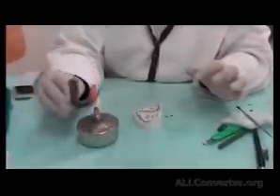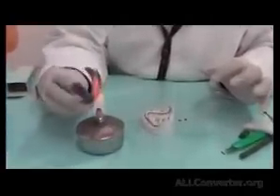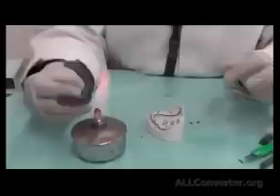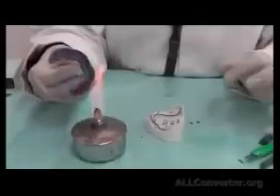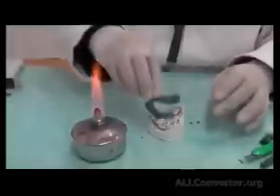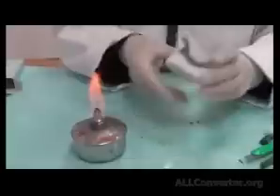And once I feel it's suitable to be placed in the patient's mouth, I heat it for the final time. I make sure that it's thoroughly heated. Cool it down a bit with warm water. Go into the patient's mouth and press into place.